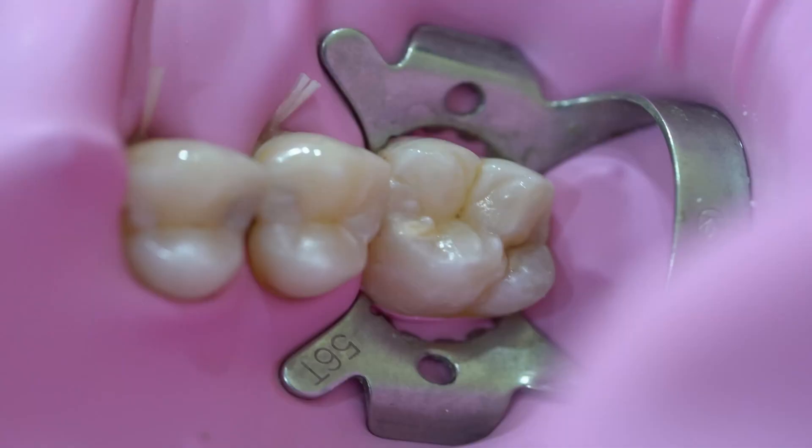If you are very tight on budget, the 14T clamp is purely optional. Your 56T and number 3 clamp should be more than sufficient for isolating most molars and all teeth anterior to the molars. Usually I put the primary 56T clamp on either a second or first molar, then make punches anterior to it to isolate up to the premolar — that is how I isolate my posterior segments.